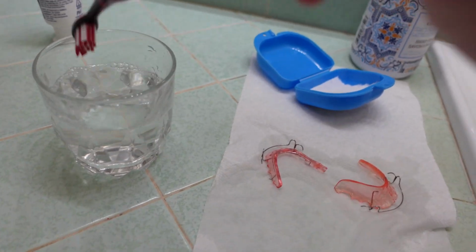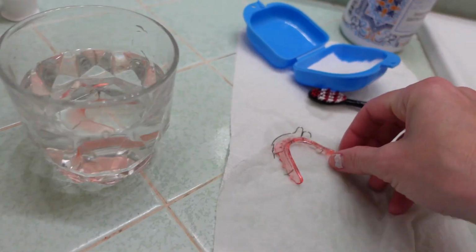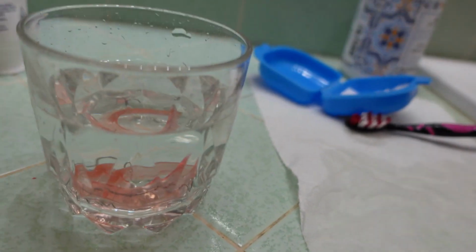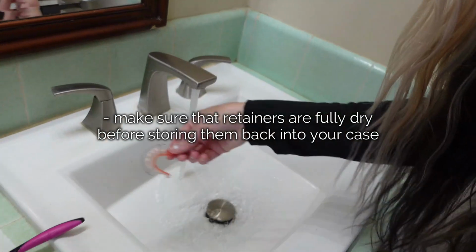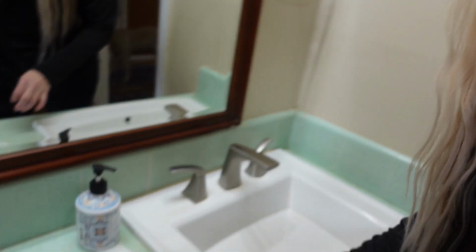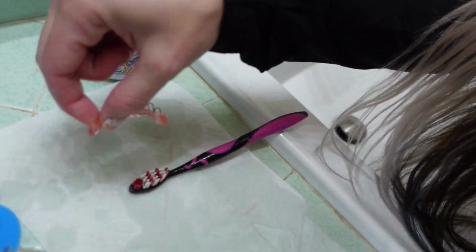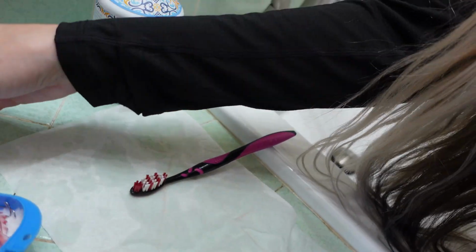Might as well give it a little stir, even though I'm sure it's fine. And then just plop them gently in there. And just leave them in for a few minutes. Now I'm just going to take it out, rinsing it again, and leave it out to dry fully before putting them in your case. So after it fully dries, put it in your case. I always put a little tiny paper towel in there just because I don't know.